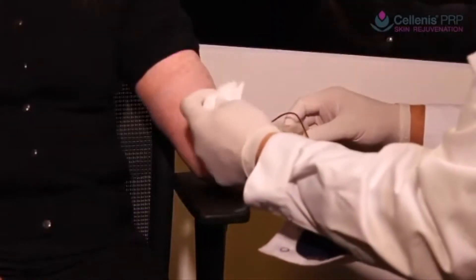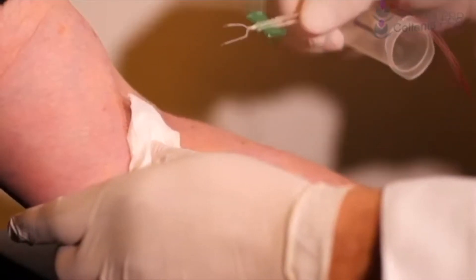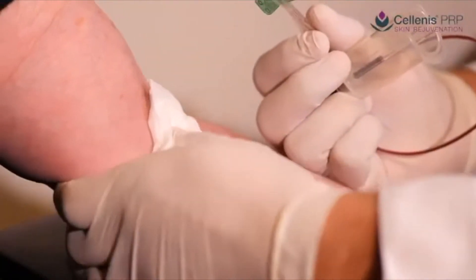Solanus anticoagulant ensures patient comfort with a pH of 7. Added dextrose contributes to longevity of the platelets.